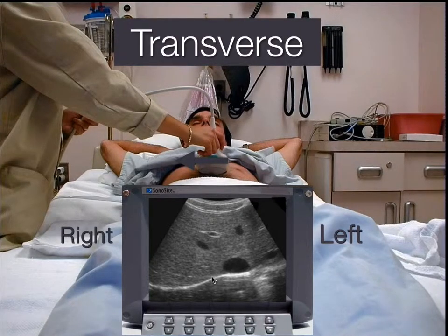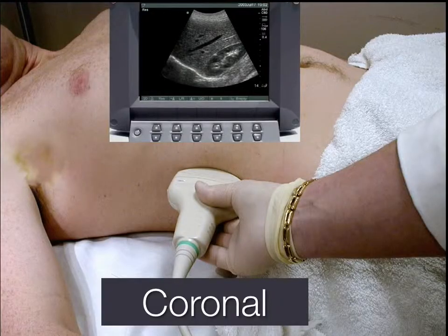Okay, everybody's cool, no problem. This is where people get confused. Coronal. Coronal, like its sagittal cousin, you aim the indicator towards the patient's head. I say it's the sagittal cousin because it's also a longitudinal plane of the body. But now the skin line is lateral, and as we go deeper into the body, the sound is going medially, and that's what confuses people right there.